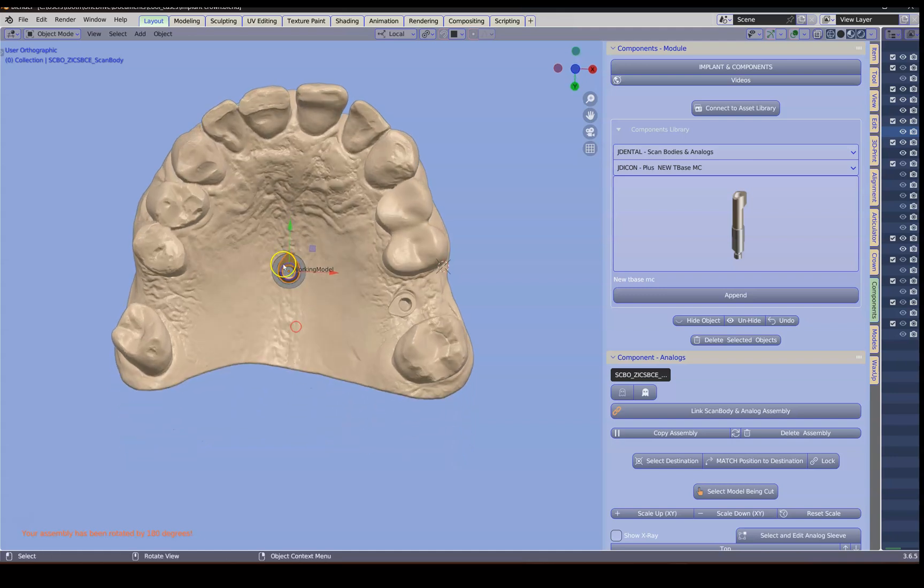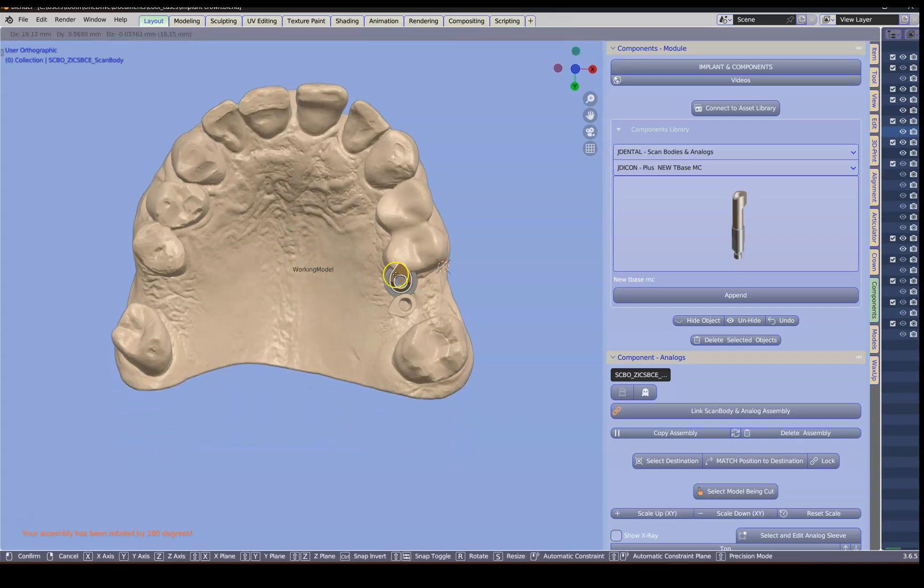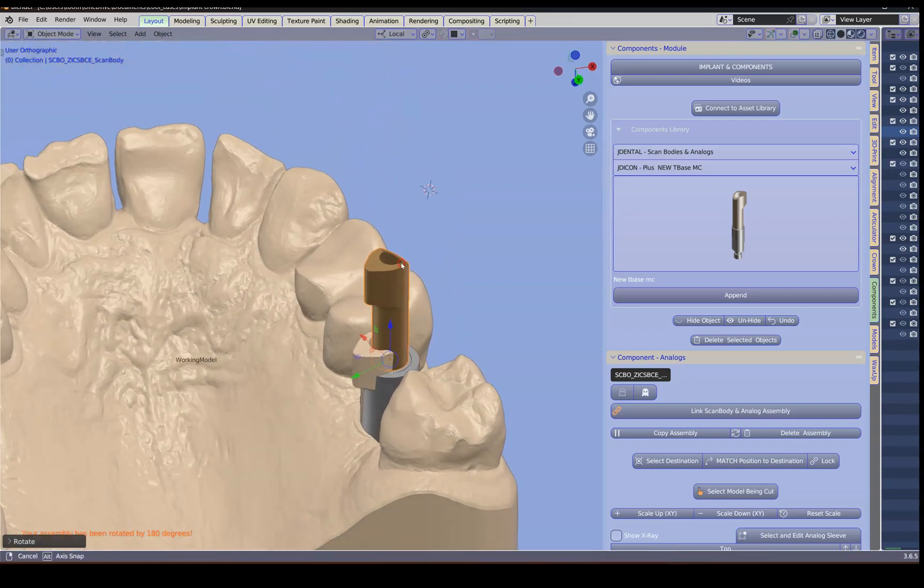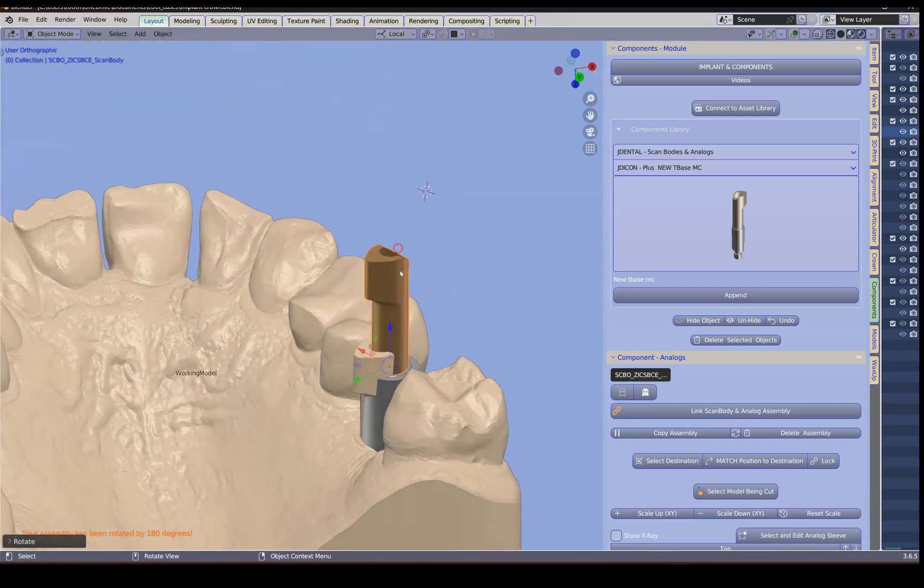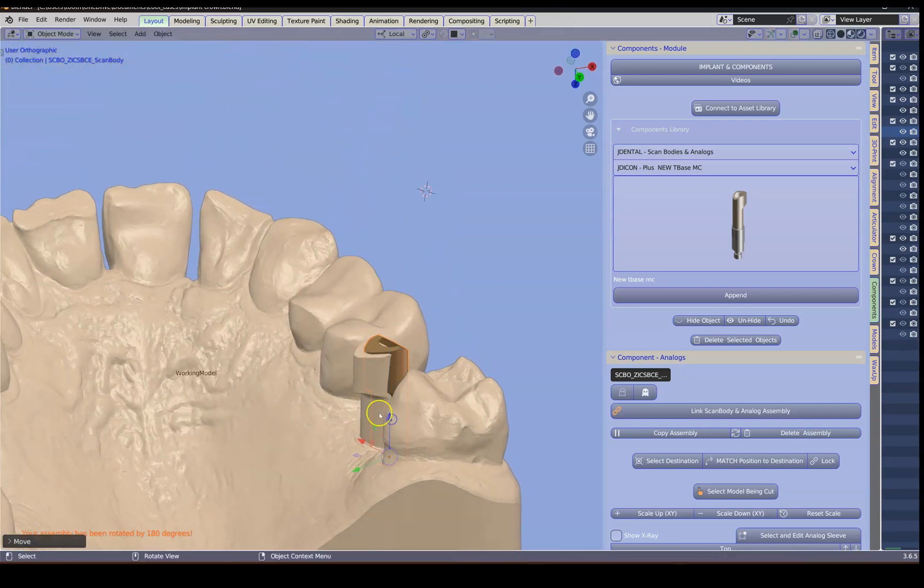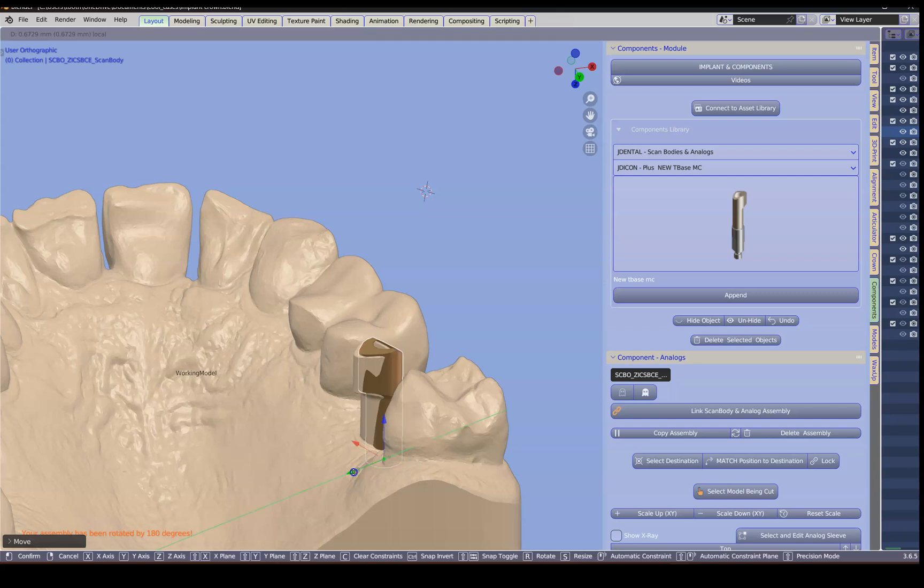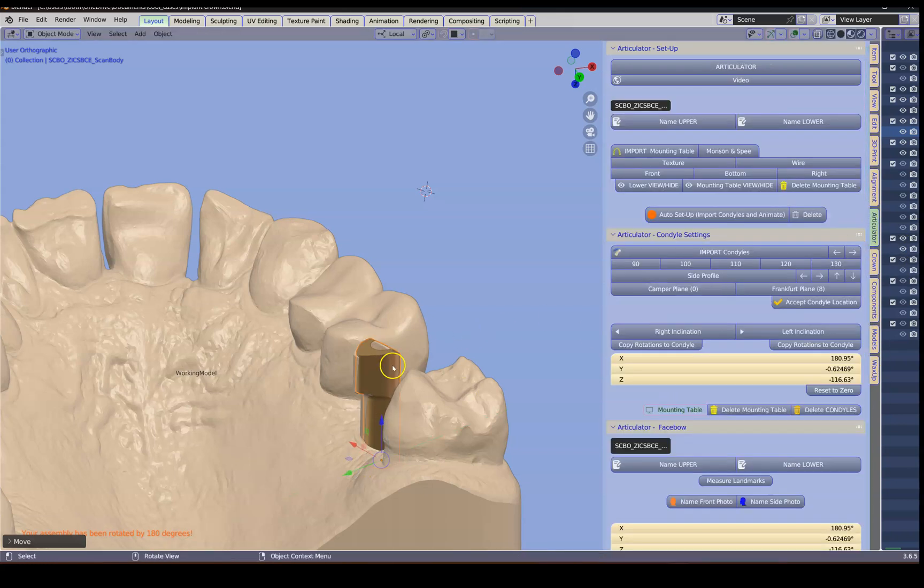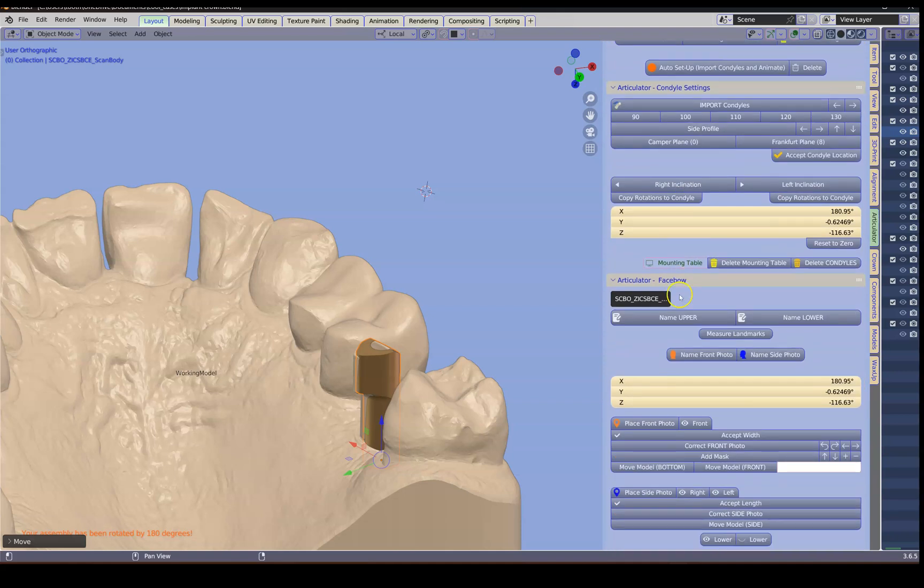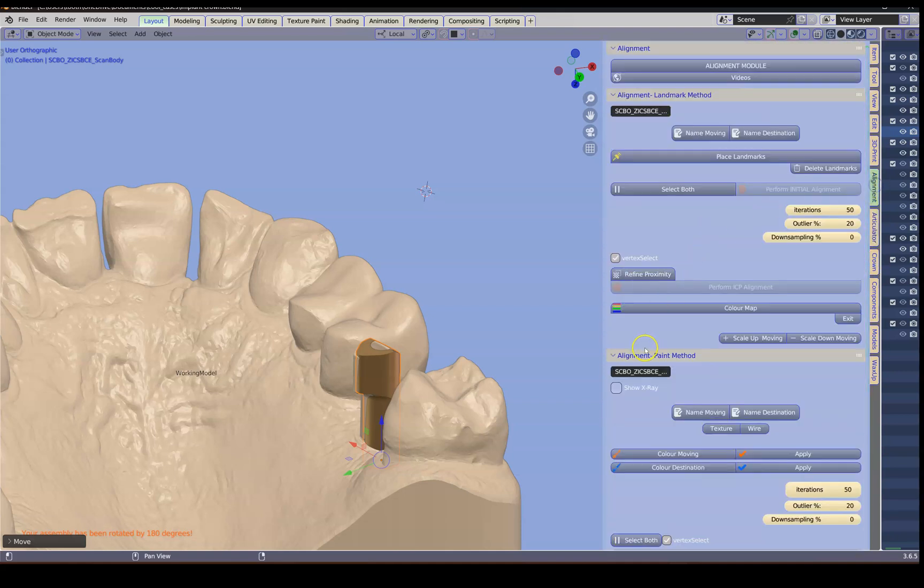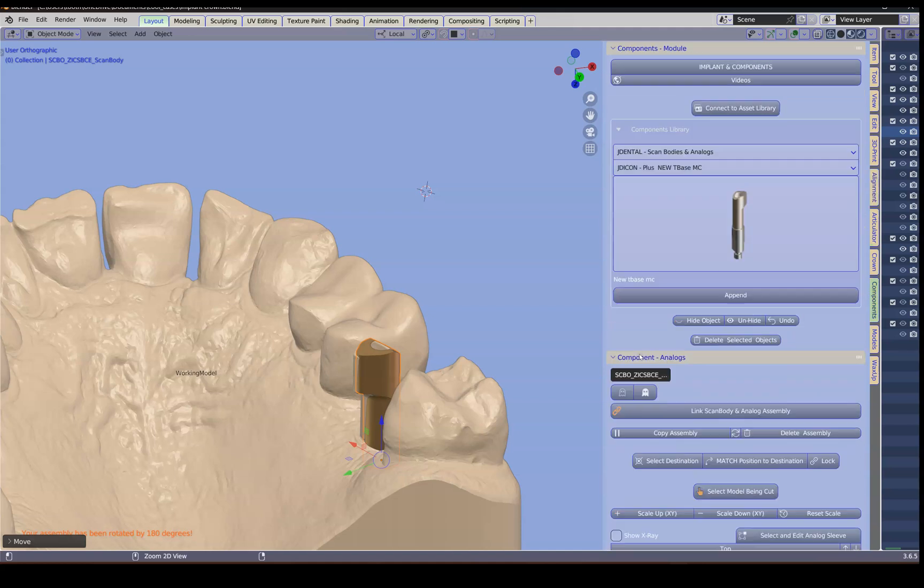Alt H to unhide it. Then I'm going to use the G key and the R key to sort of put it into a semi position. Following that we're going to go to the alignment module. This becomes my moving. We're going to use the paint on method.